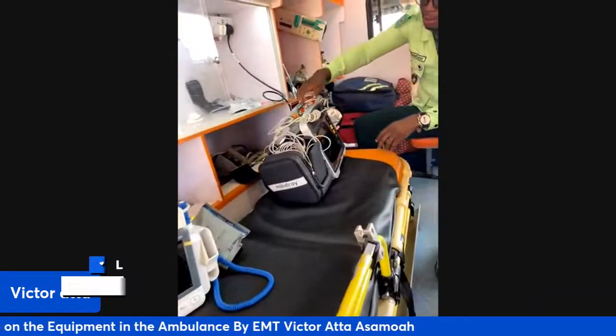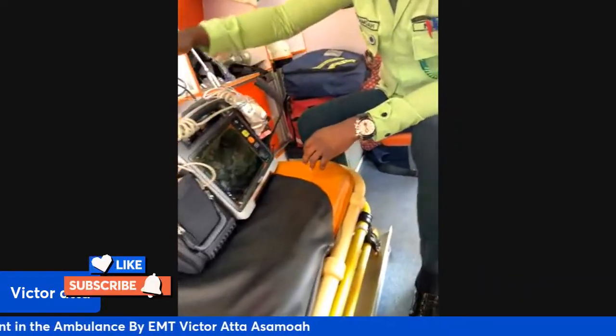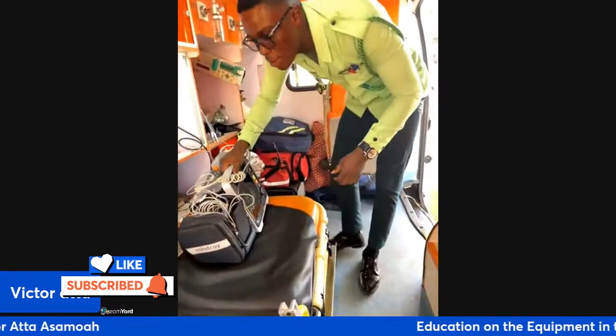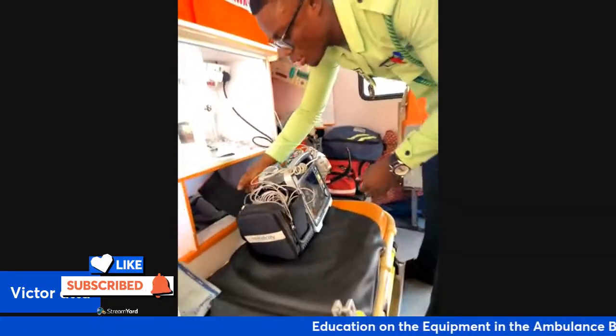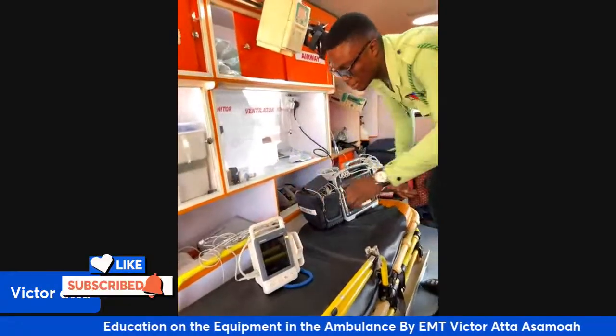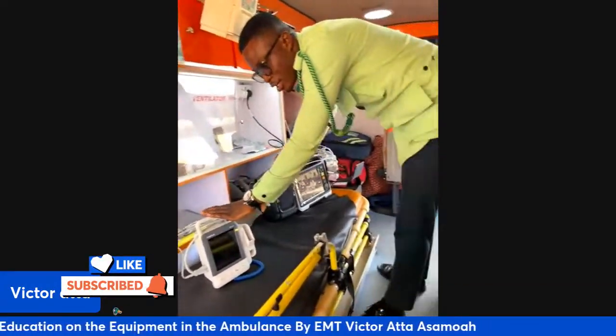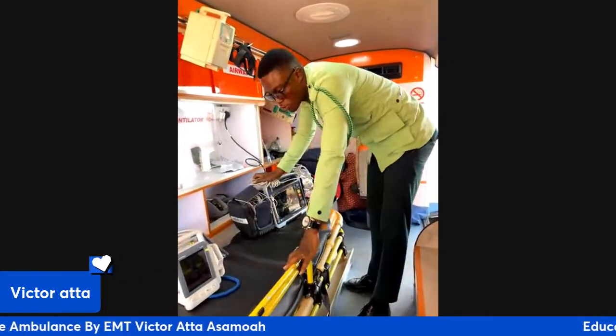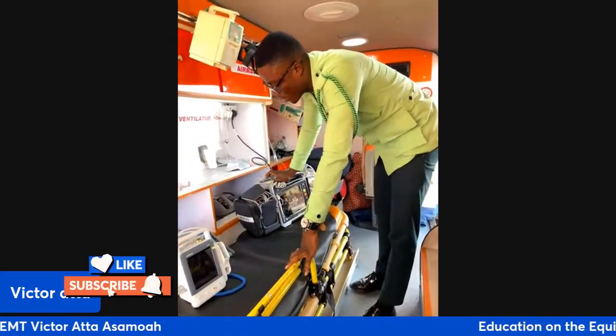To start with, we are going to start with the patient or cardiac monitor. We have two types of cardiac monitors. We have the small one, which is to check the normal vital signs in your patient when you're transporting a patient from one facility to the other.